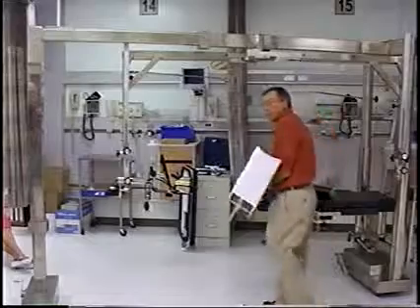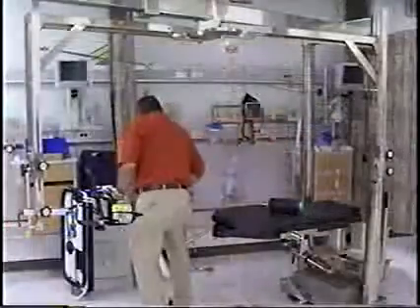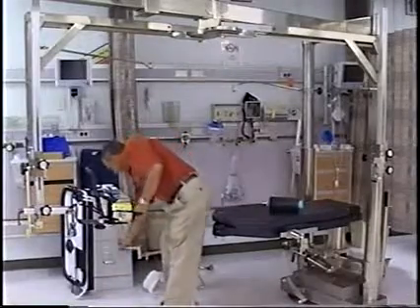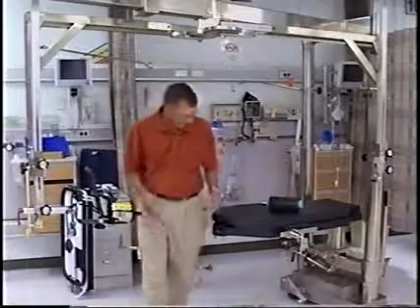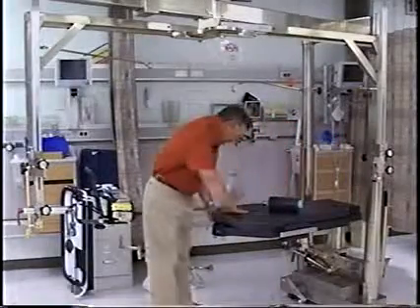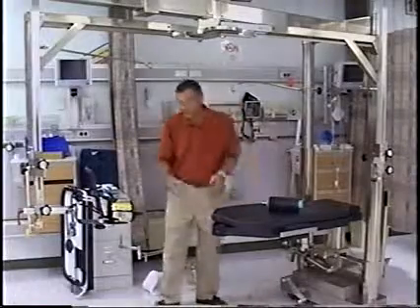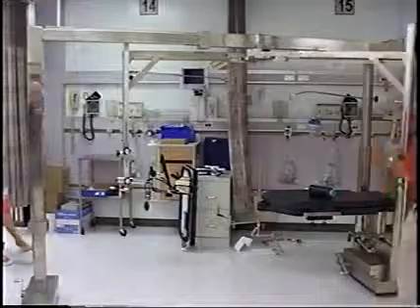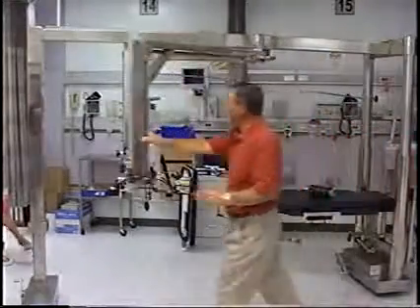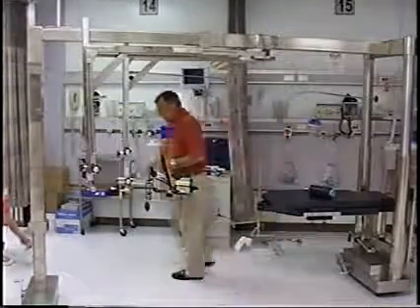We always hope for the right side. Because it's the back table, and you're going to have to move the back table around. So let's set it up for the right side, and I'll show you that, in my opinion anyway, the way the table should be stored. That way, at 2 o'clock in the morning, you won't be running all over the OR, back in the storeroom, looking for parts and pieces.